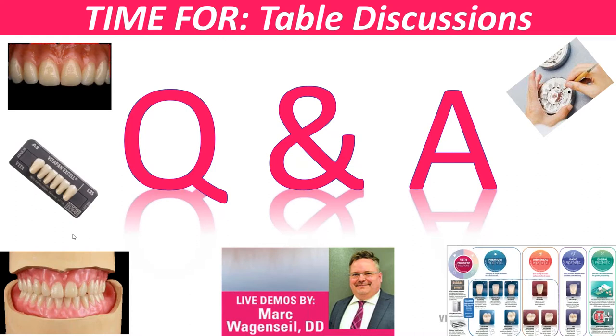Do not use the word bite. Use the word swallow. First off, the command words you use. Swallowing will always take them back to their physiological center. So you're accessing the subconscious command of swallowing. When we swallow, it's not conscious, it's an unconscious act. So you're asking the person to swallow, and they'll go in and touch together in their physiologic centric.